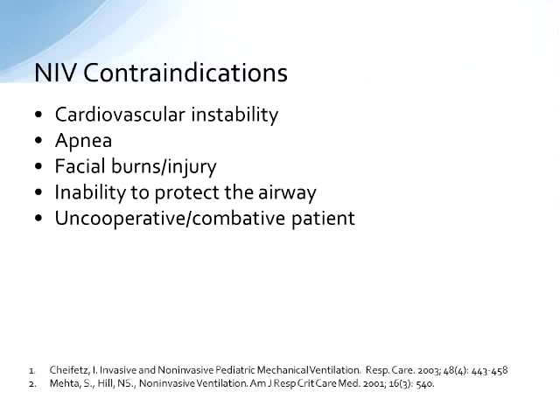If you have significant facial injury, you wouldn't be able to tolerate the interface. So if you have big bad facial burns or significant facial trauma, this is not something that we would always consider for those patients, at least not in the acute phase of that. Patients have to be able to protect their own airway, so if they are very, very confused or have a really significantly decreased level of consciousness, they're not able to protect their own airway, so they shouldn't be on non-invasive. Or patients that are uncooperative or combative.